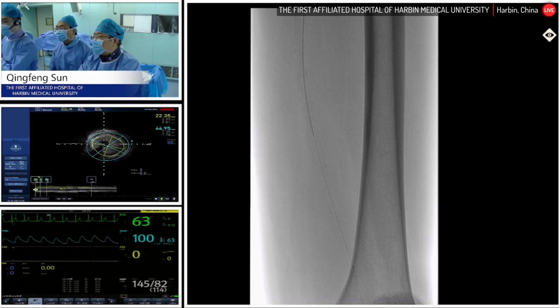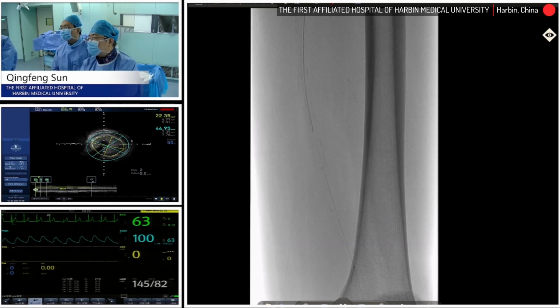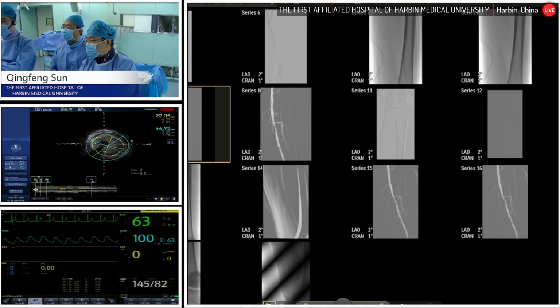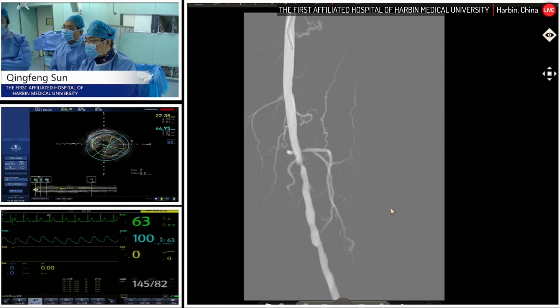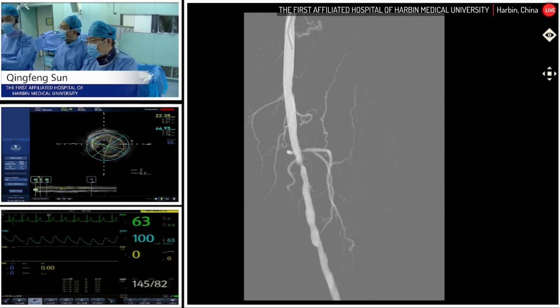Okay, this is a roadmap before we cross it, and it's quite clear. So this is a severe stenosis with a lot of collateral generated. Are you more inclined to think it's chronic disease like fibrosis or soft plaque, or more like thrombosis? It's hard to say. That's why we're having IVUS here. Yeah. So next one, please.